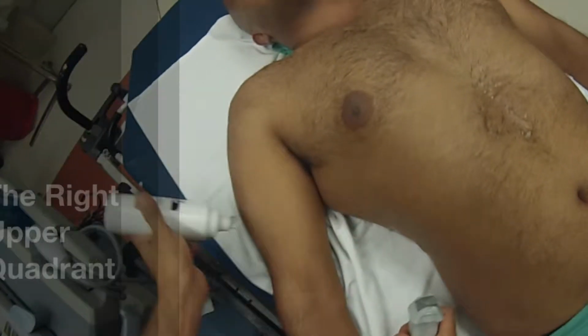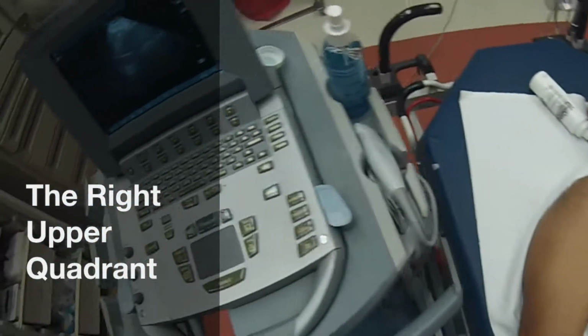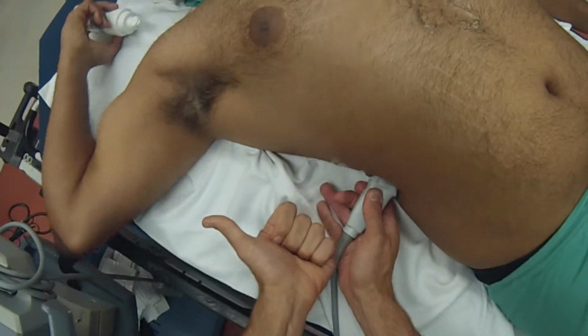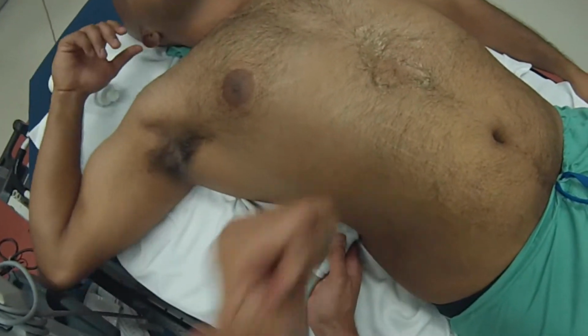Down to the right upper quadrant, and notice again I'm in a coronal plane. The indicator is to the patient's head. In the subxiphoid view, the indicator was to the patient's right.